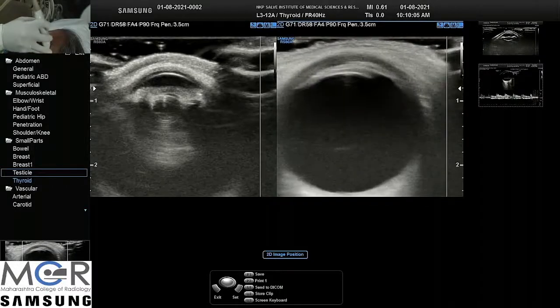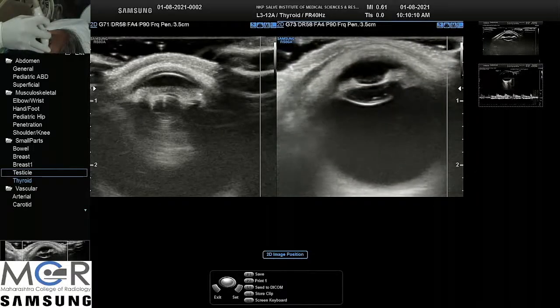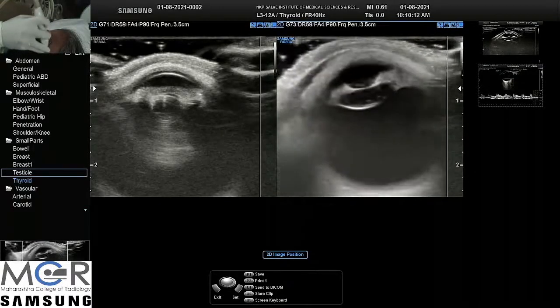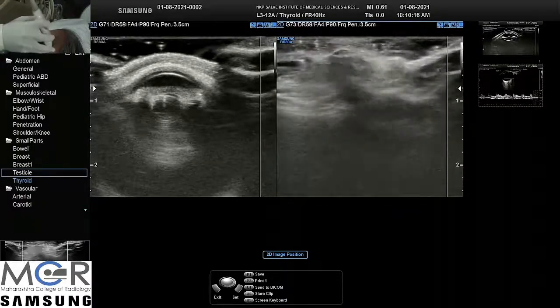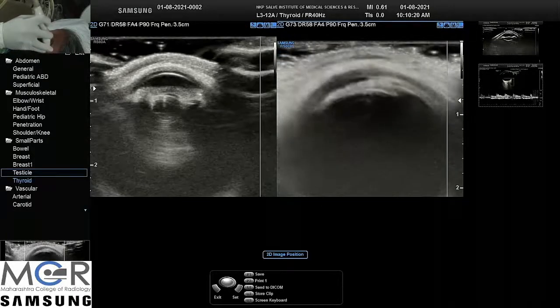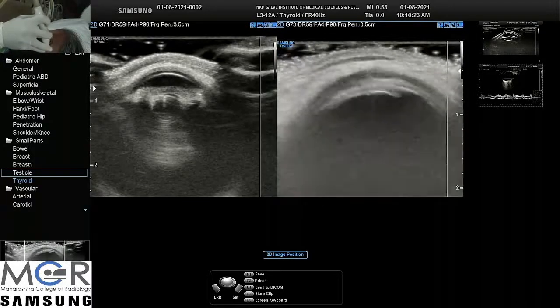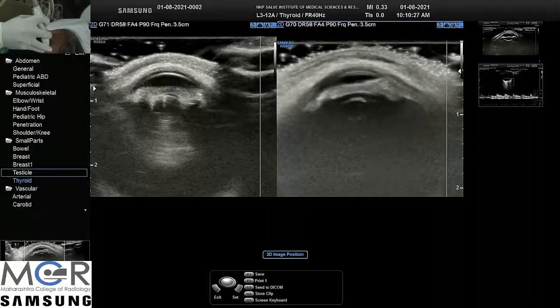And this is the anterior chamber. You can see the native lens there. There is a cataract. Partial opacification is there. I'll magnify a little bit more, adjust the focus to the minimum depth rather. See that the cornea is normal.